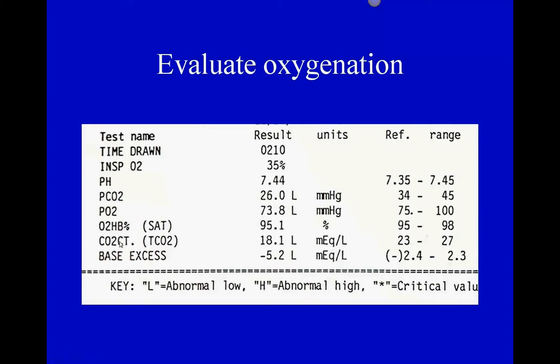Okay, next we go to the O2 hemoglobin, or the saturation, and we have 95%. So we said unless that was less than 90. So I'm going to make a note to myself that this person's breathing extra oxygen to keep them okay, but they are not hypoxemic.